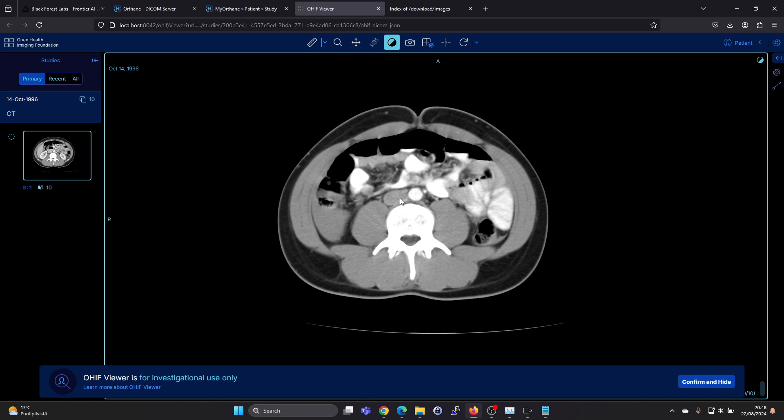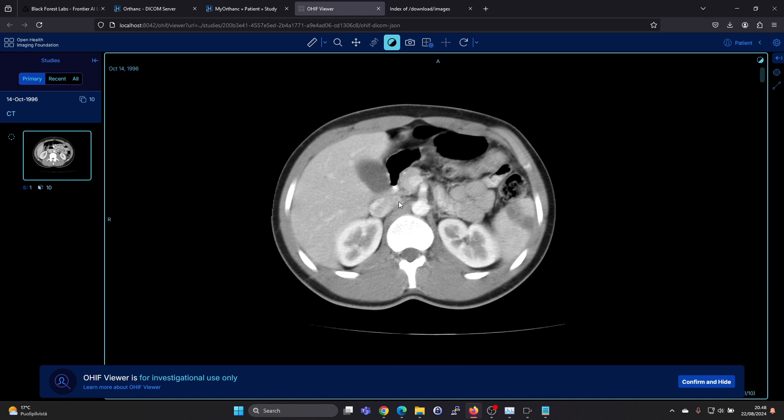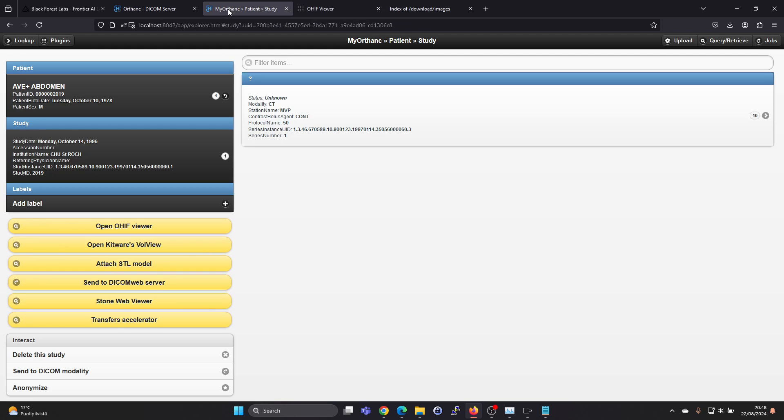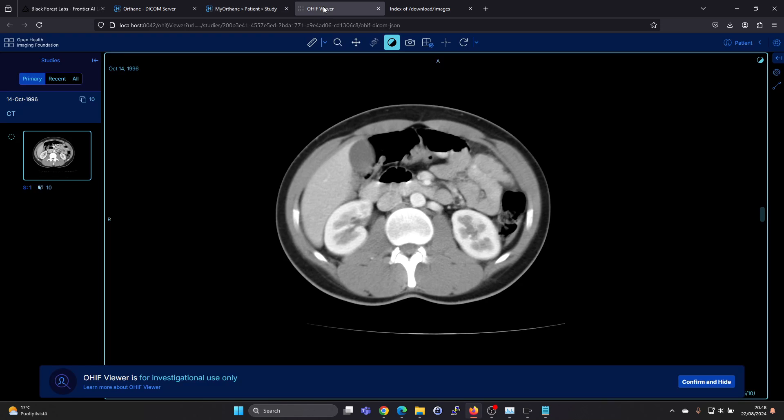And in here we are able to view the image. We can see this is running on localhost in the same port, just a different URL.